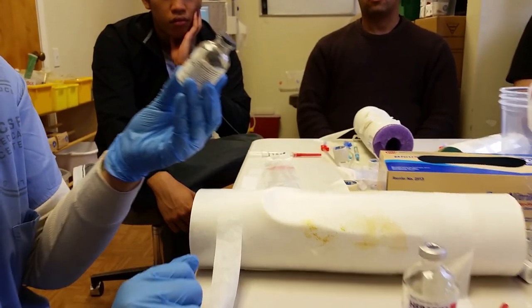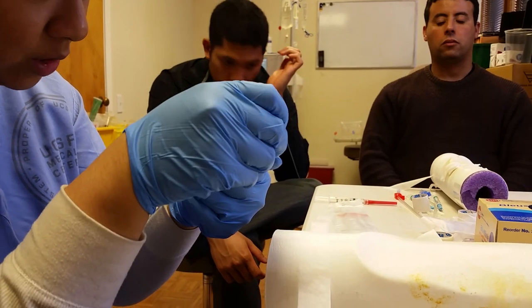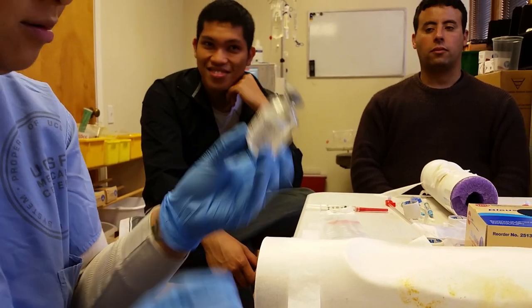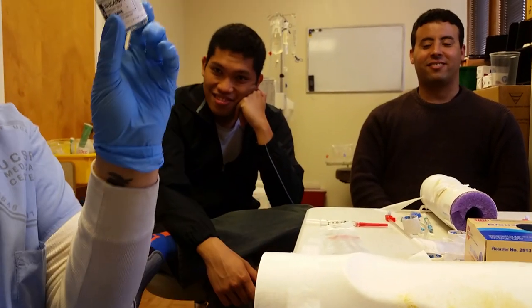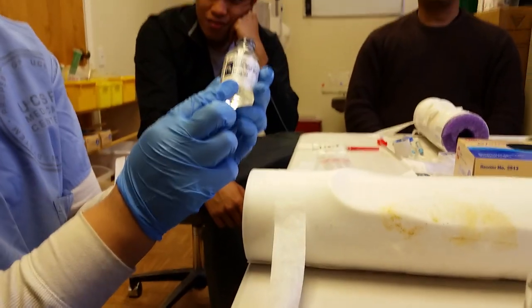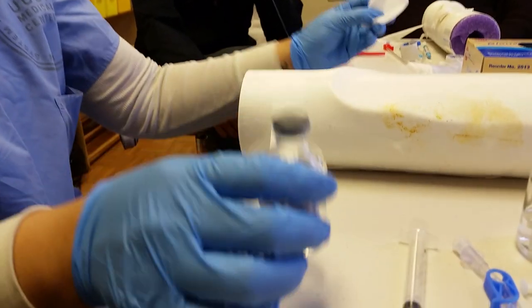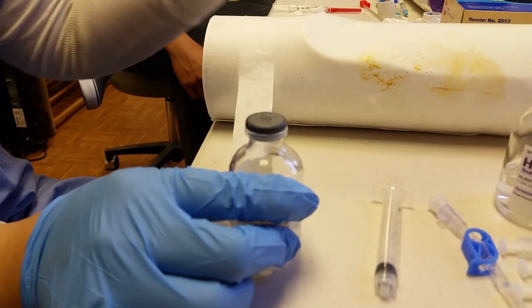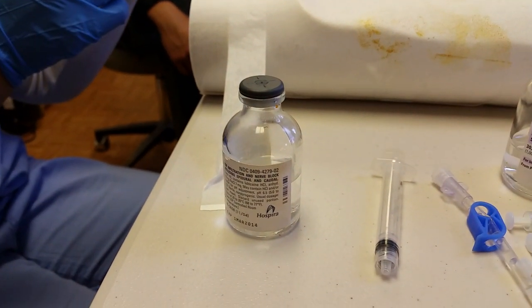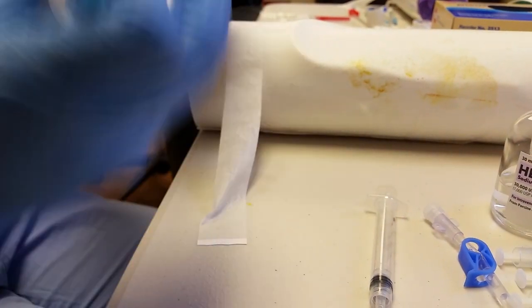Check your lidocaine to see if it's expired — check the expiration date. Let's pretend it's current. You want the initials and the date on the lidocaine bottle. So if it's already been used, you always want to clean the top with alcohol. I normally pull back point five. Take the needle out, put it in, push the air in.